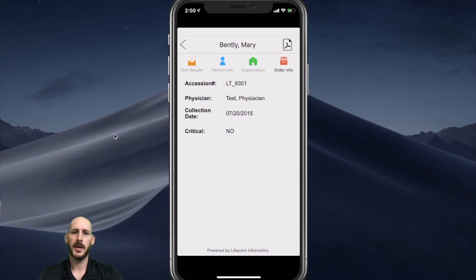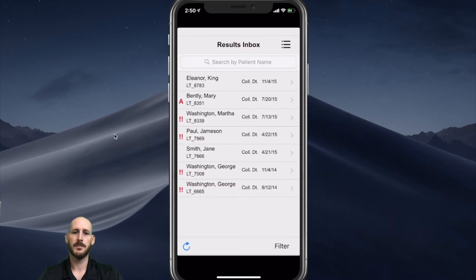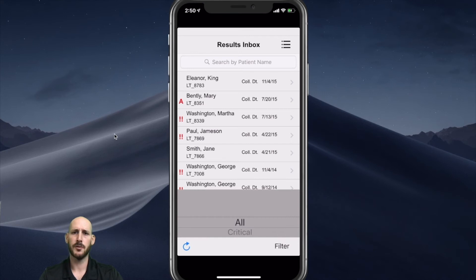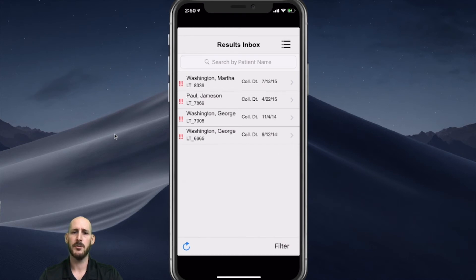Going back to the inbox, we can also set filters. In this case I've set a filter for critical values, but alternatively can also filter for certain providers or different disciplines such as pathology.